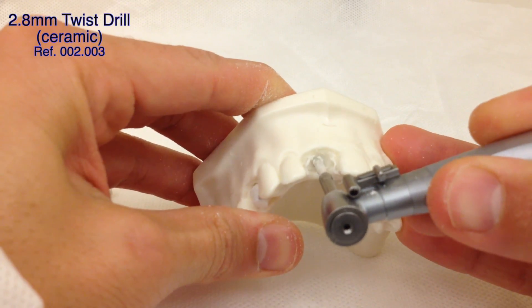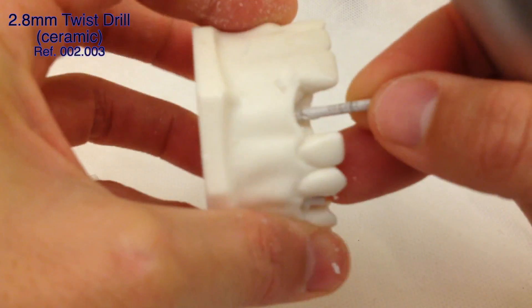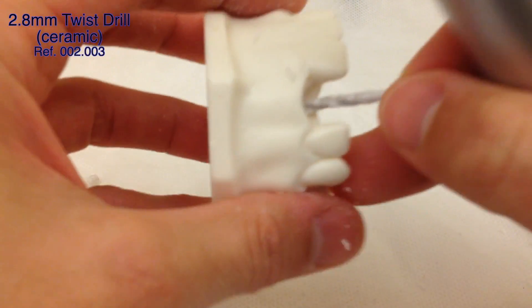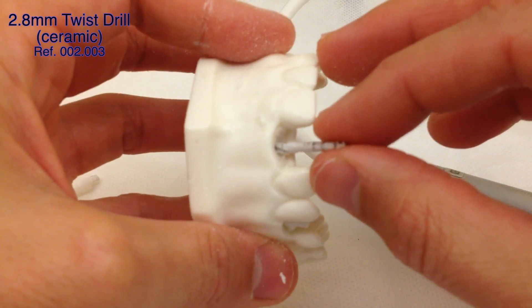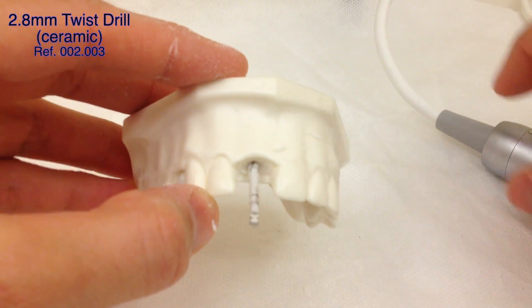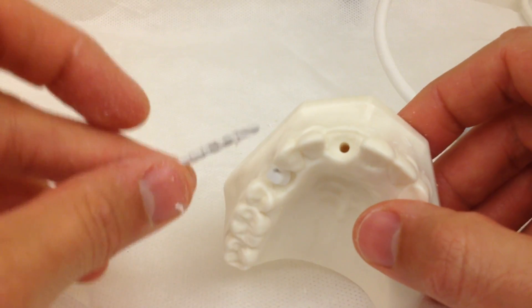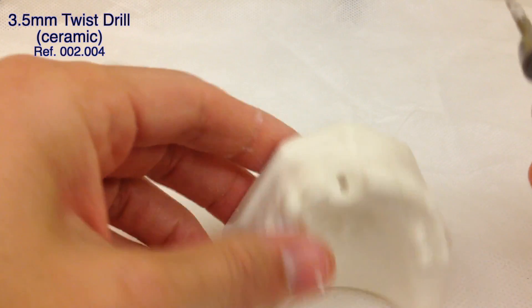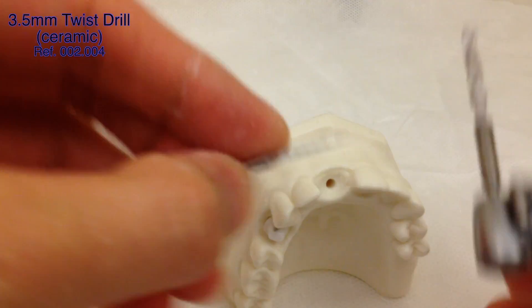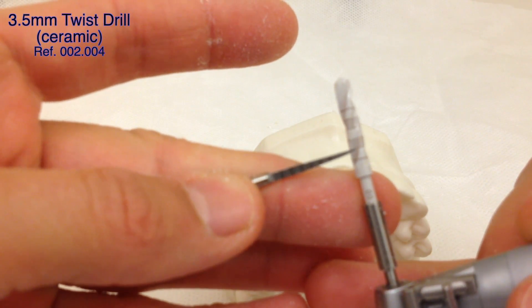We can drill slow and sometimes collect the bone particles that come out. It looks like we are already at the 14 millimeter line — yes, the last line is 16 so we are at 14 right now. The position is pretty centered so we don't have to correct anything. We're going to increase the diameter — this was 2.8, so now we're going to do 3.5, which is the last twist drill we'll use for this type of central incisor implant called CeraRoot 21. We're going to drill all the way to 14: the markings go 6, 8, 10, 12, 14.